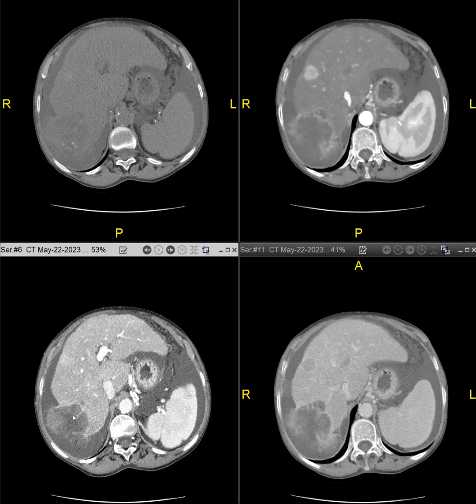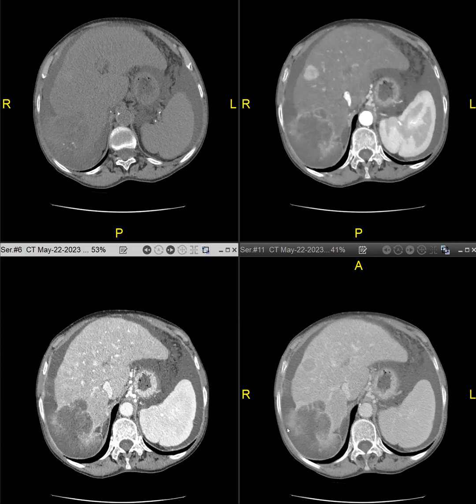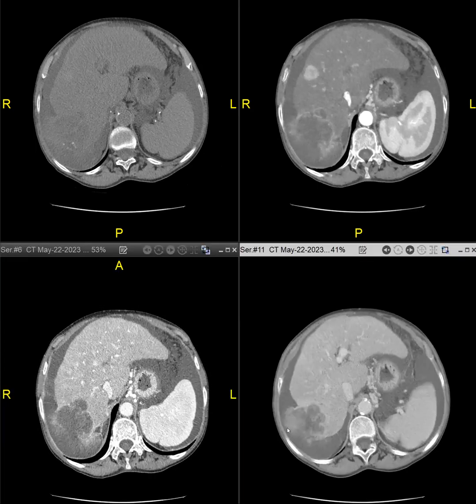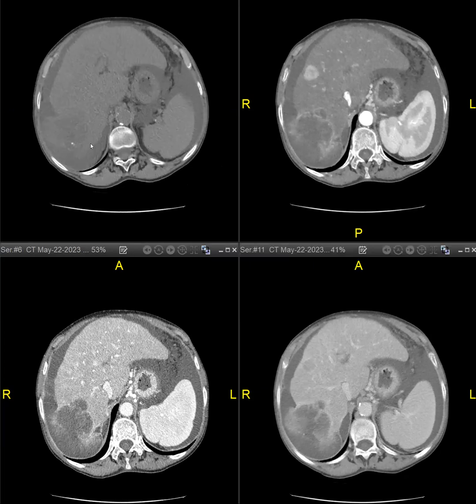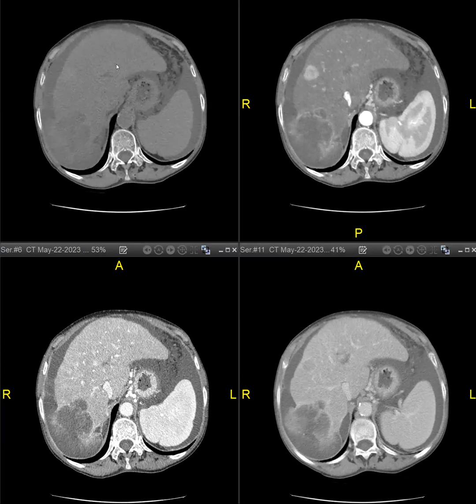So that was reported as LRM. And then you can see the lesion has a little bit of calcifications in it.